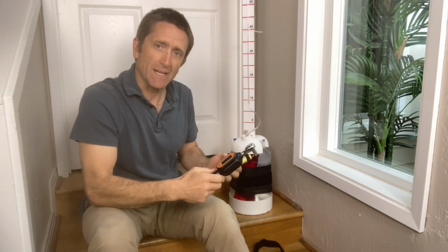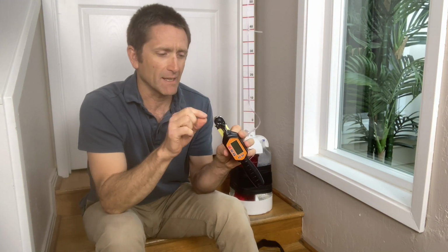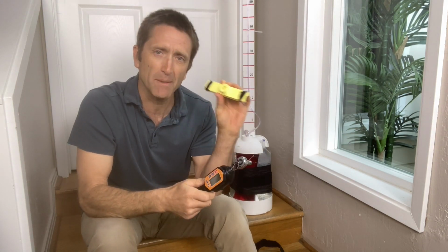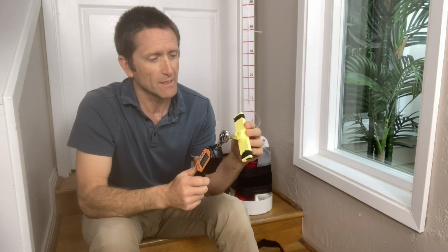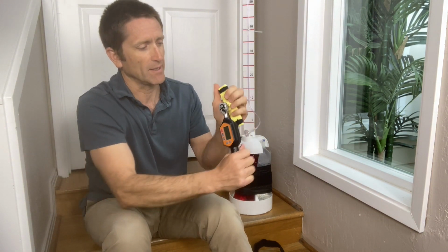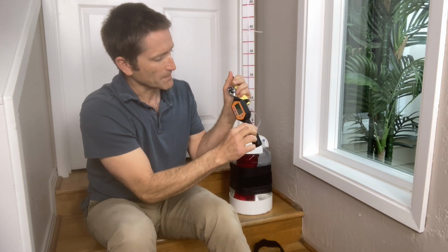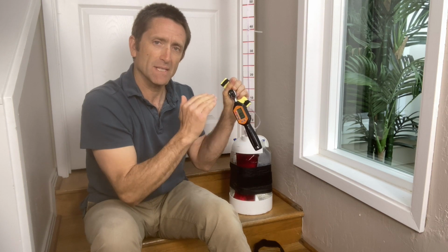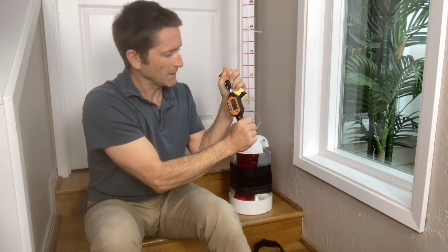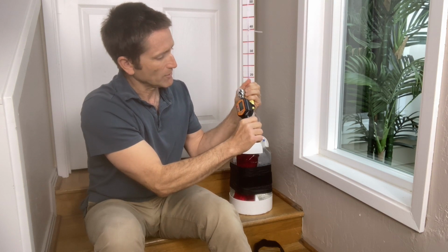And what I've done is I have taken this digital torque wrench, added an adapter here, and I 3D printed an adapter that connects to Windlass tourniquets. So that just fits in here, and I can grab and twist. As far as settings go, I have this set to Newton meters, and I have it set so that it will read just the peak. So there, that is 6.60 Newton meters.